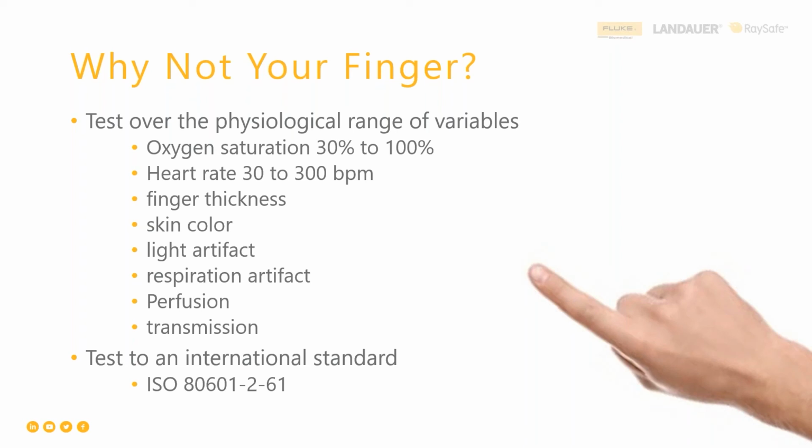Do you? The answer is no, we don't know. That's the whole thing here. We don't know, and we need to have some credible, repeatable way to perform this functional test. So your finger's not good enough.